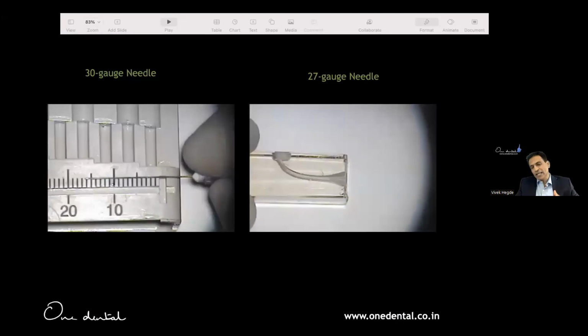Now we saw which needle. I told side vented needle. I'm talking about that because we are now talking of a solution called hypochlorite. Why hypo? I'll come later. Now that particular needle, because that's a means to the end, right? I'm coming backwards. We have two types of needles. We can have even 23, 24, 26. They're all injection needles. I don't like them.